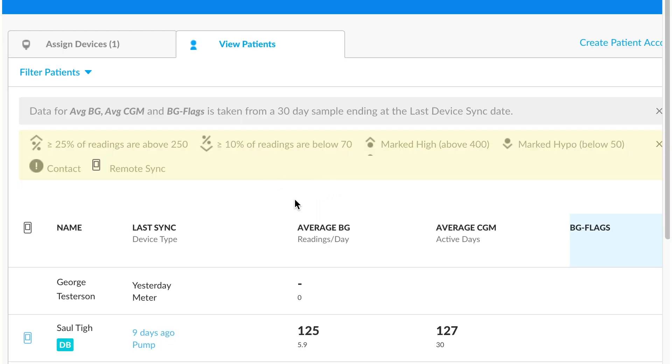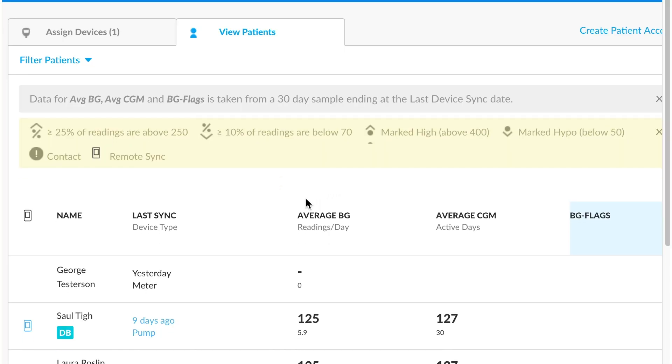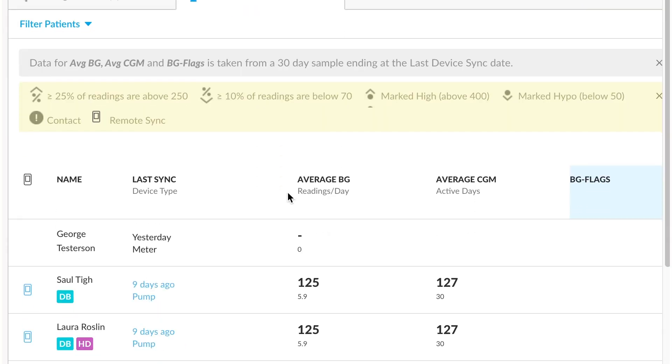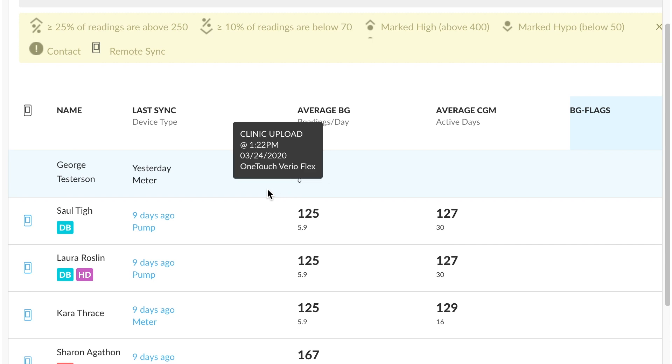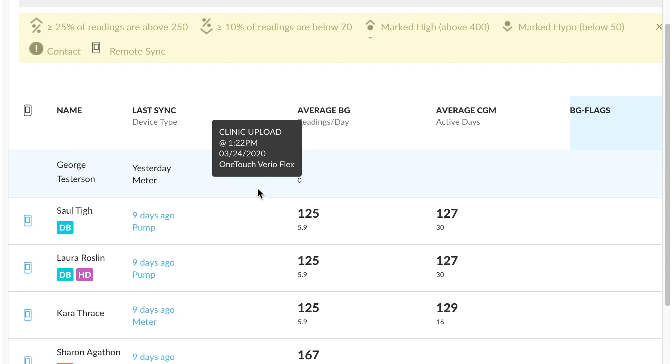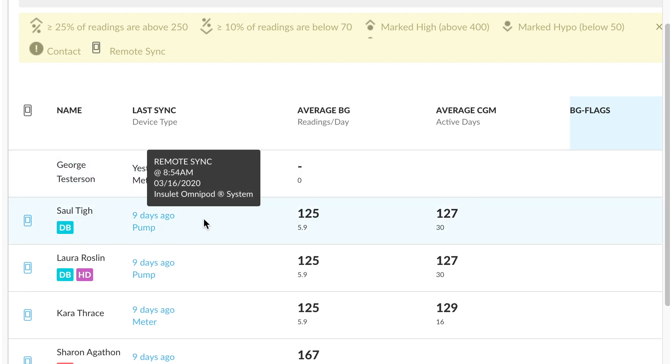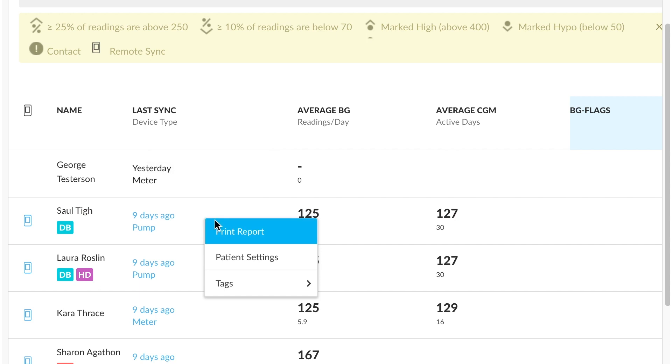Similarly, if you ever want to access the patient profile or the patient settings from the patient list itself, you can just simply right click on the patient and go to patient settings.